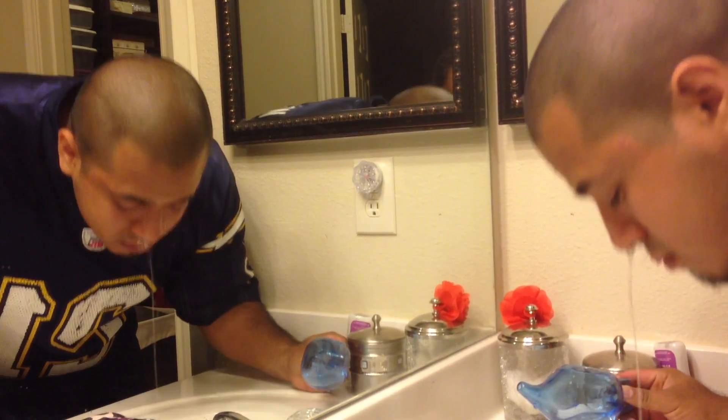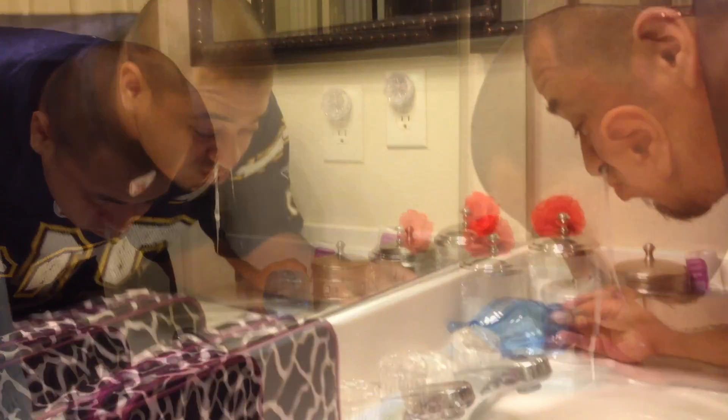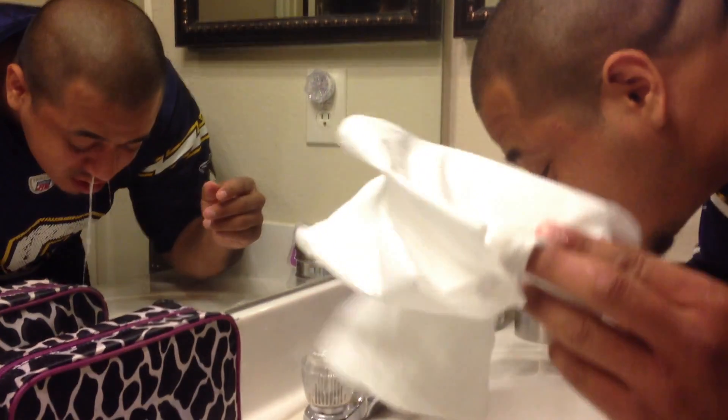Now breathe out your nose. Let me get some paper. That was gross. Who brushes their teeth in here?